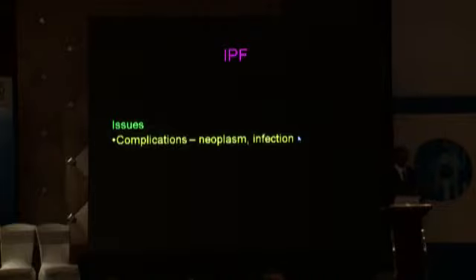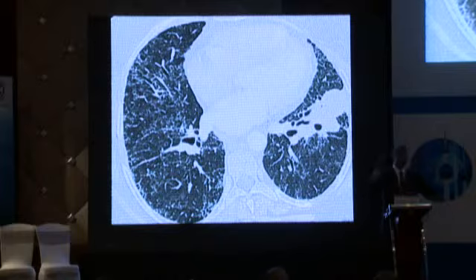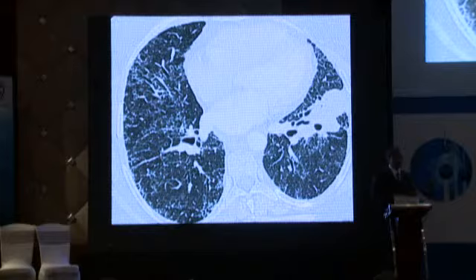When we see patients with IPF, we follow them up radiologically virtually every year. And when we do that and we put all those scans together and we're scrolling on the workstation after syncing them, we also look for superimposed complications. The incidence of malignancy in IPF patients is 13 times that of the normal population, and they also suffer from superadded infection.